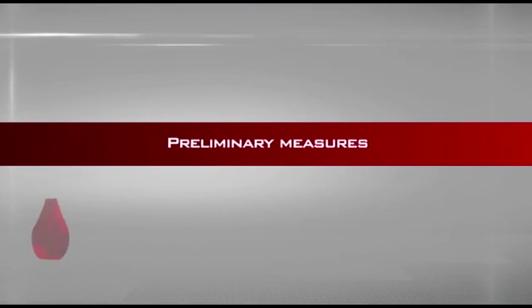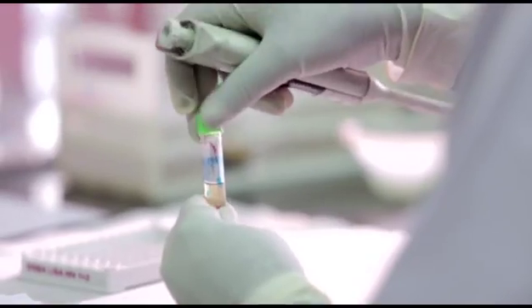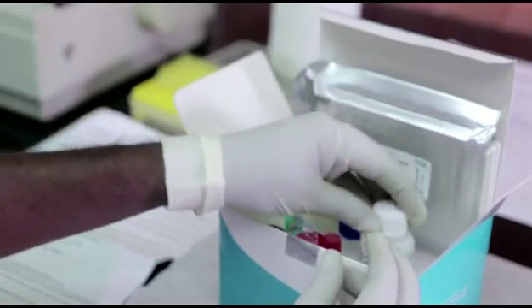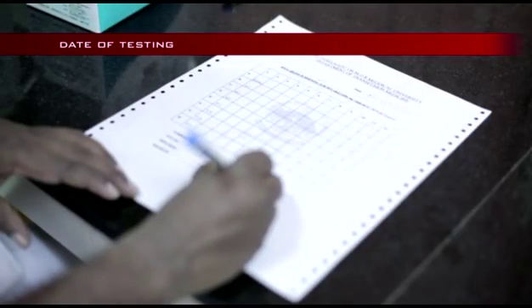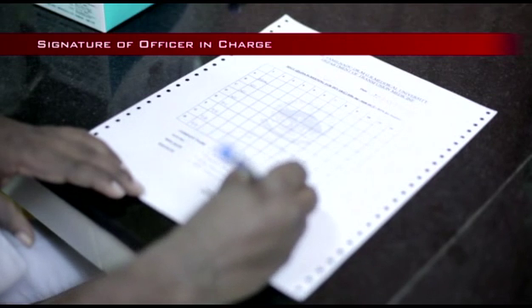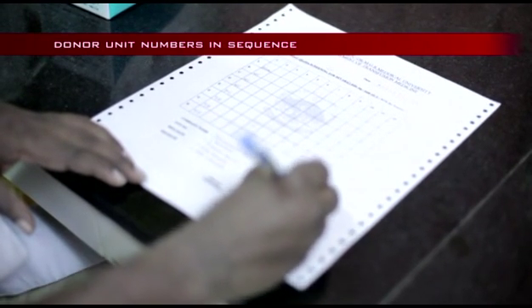Preliminary measures. Sample identification is done by cross-verifying donated blood unit numbers with corresponding pilot tubes containing serum. Check the reagent kits for lot numbers, expiry date and any visible abnormal changes. Prepare worksheet with particulars such as name of the test, date of testing, reagent lot number and expiry date, name of the technician performing the test, signature of officer in charge, and unfilled columns for entering positive and negative controls and donor unit numbers in sequence.